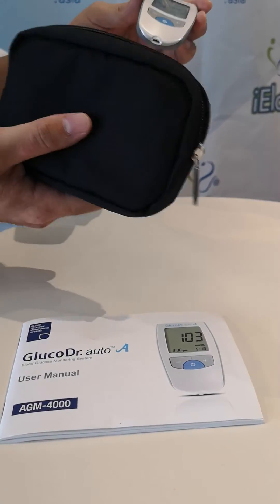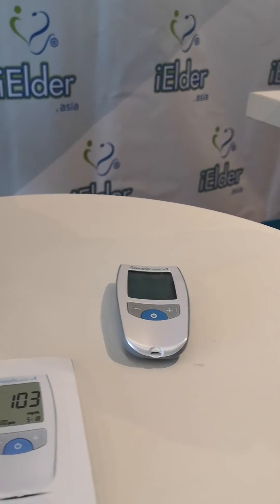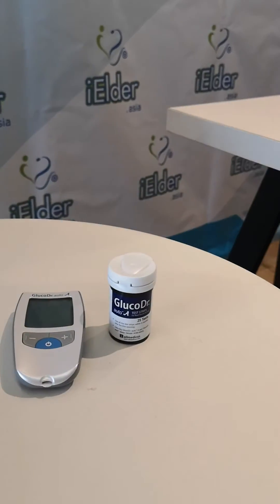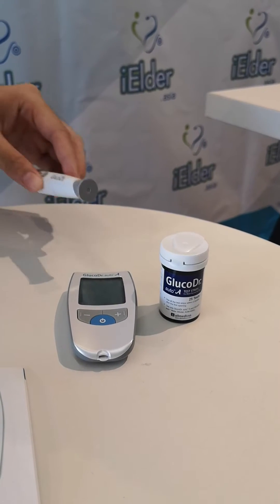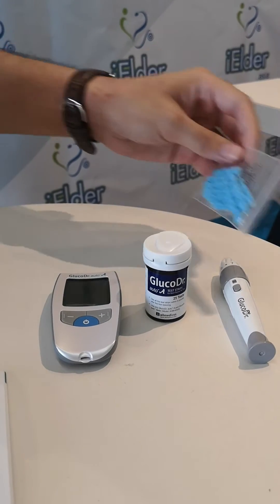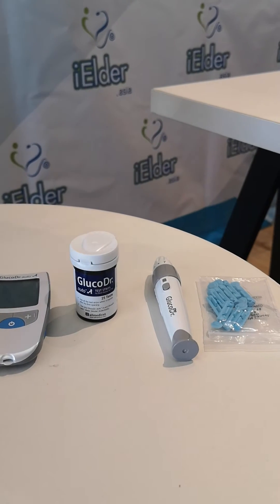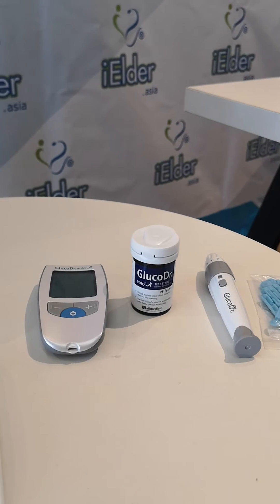Basically, within this pouch contains the glucose meter itself. You have one bottle of test strips which contains 25 test strips in total, one lancing device, and 10 lancets which you insert into the lancing device for use — and that is pretty much it inside the pouch.